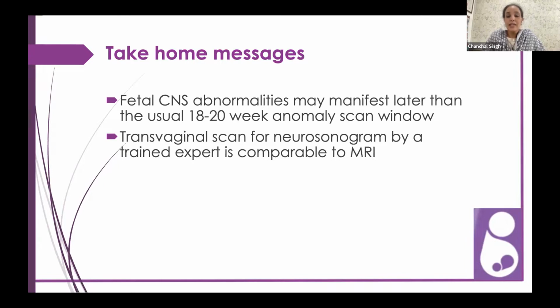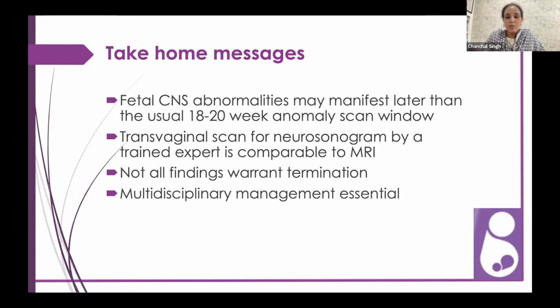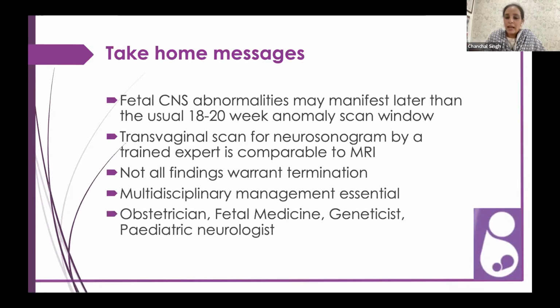And a transvaginal scan in the mid-trimester, as per published literature, when done by a trained expert, is comparable to MRI. An MRI may not be universally available to everybody, and even where it is done, people may not be adept. So we are constantly evolving in our imaging modalities and their interpretation. The important thing is that not all findings warrant termination. So it is a multidisciplinary management. We all have to put our heads together and counsel these parents so that we walk that fine line between unnecessary terminations and a blind carrying on with pregnancy and dealing with these children later on.